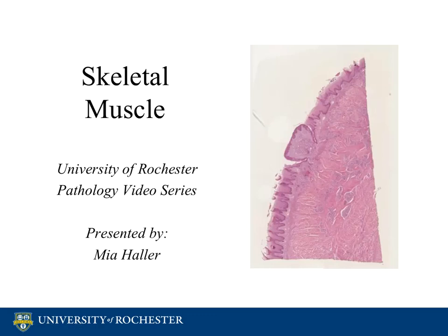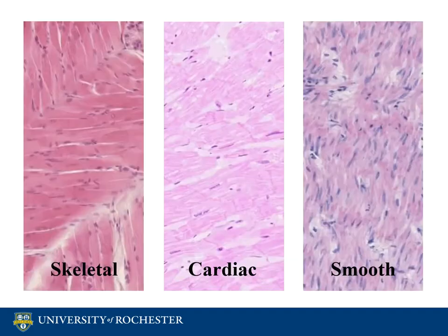Welcome to the University of Rochester Pathology video series. This video will review the normal histology of skeletal muscle. Muscle is broken down into three classifications: skeletal muscle, cardiac muscle, and smooth muscle. Each of these groups has characteristic differences in structure which lead to specialized functions. This video will focus solely on skeletal muscle.